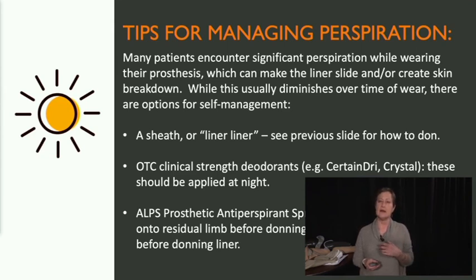Crystal is also one that is a natural product. So have the patient try applying it the night before. In the morning, you can shower if you want to, and it shouldn't affect that. And then try to don their liner, or have them try to do it in the morning and play around with it and see what seems to work.